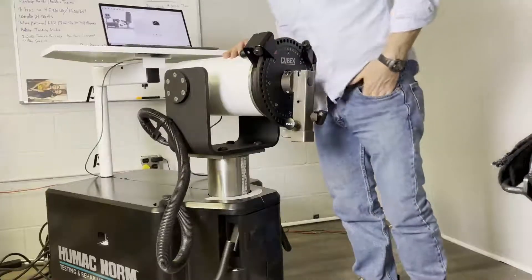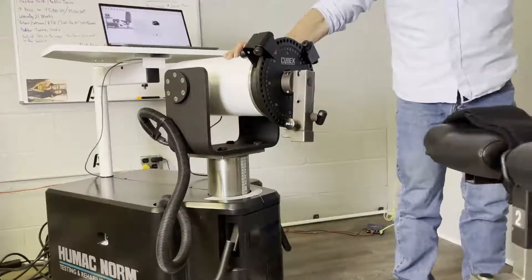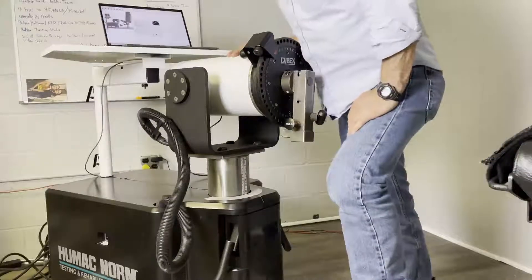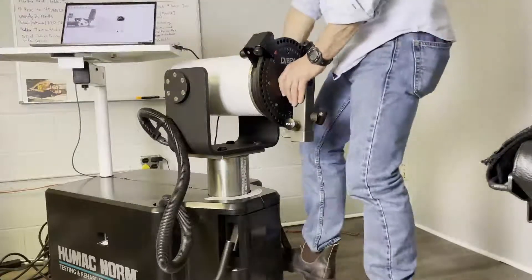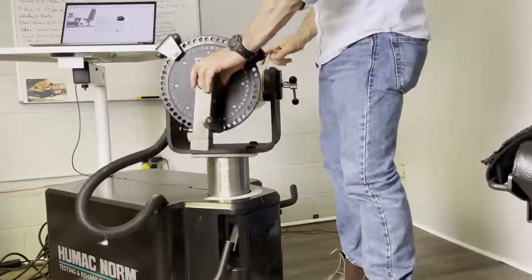The next thing says set the chair rotation to zero. So if the chair rotation isn't at zero, set it to zero. Then set the dynamometer tilt to zero — this is the dynamometer tilt angle. It should be at zero.